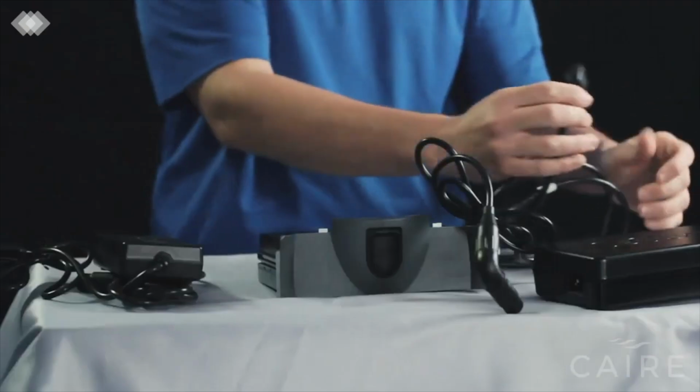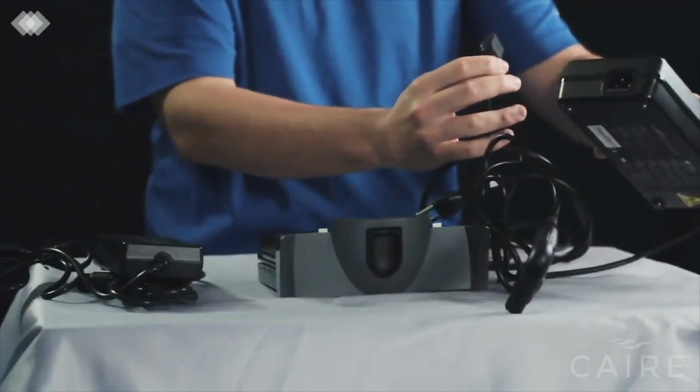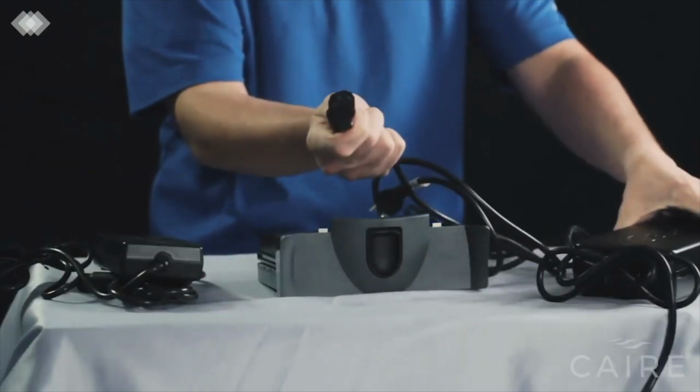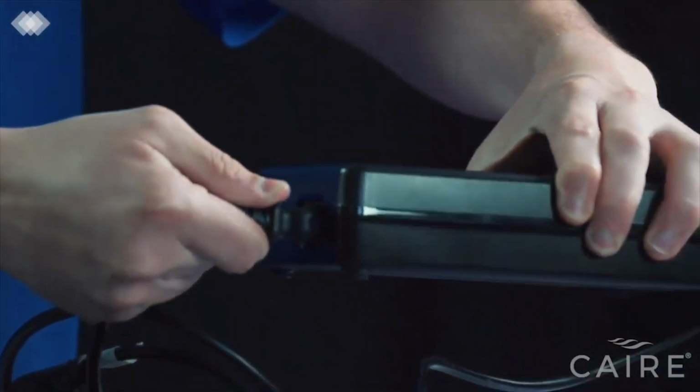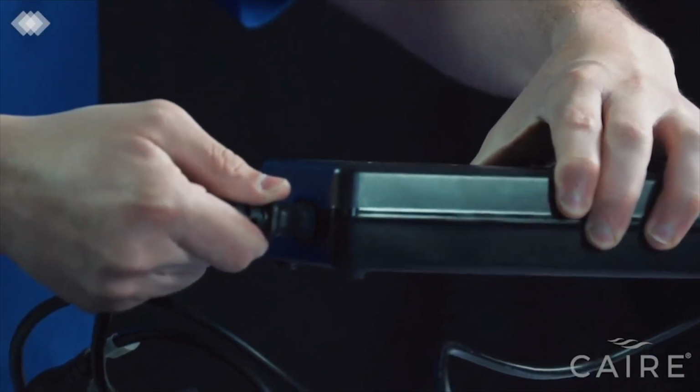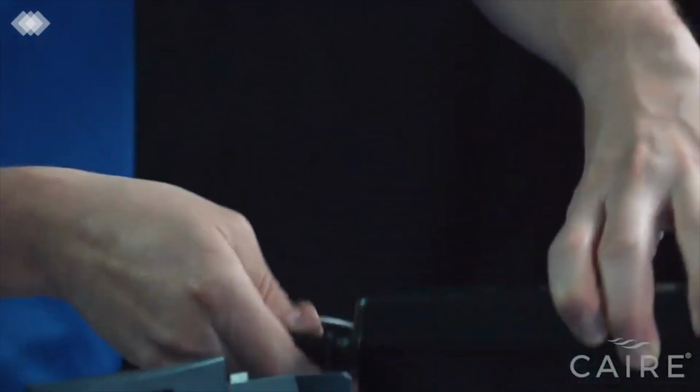You also will receive a power cord for the country that you're in. You'll need to install this power cord in the AC power supply. So you take this end of the power cord here and install it into the side of the power supply. Push tightly to make sure it's firm, and now your power supply is ready to use.